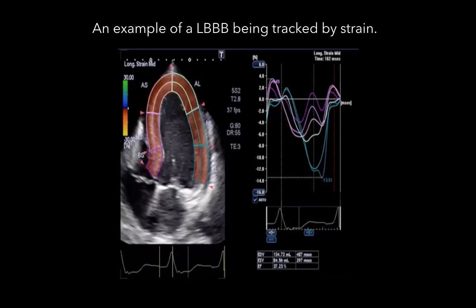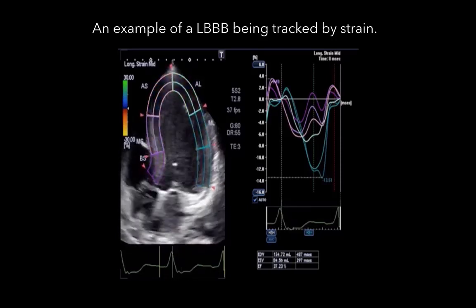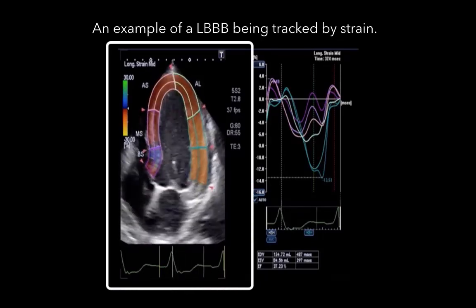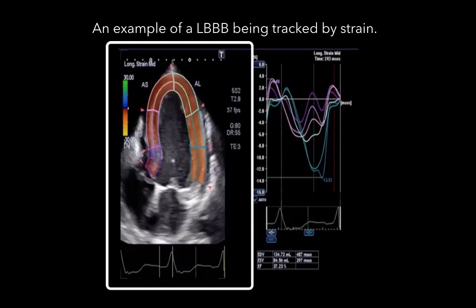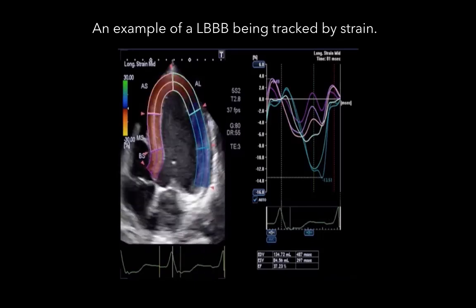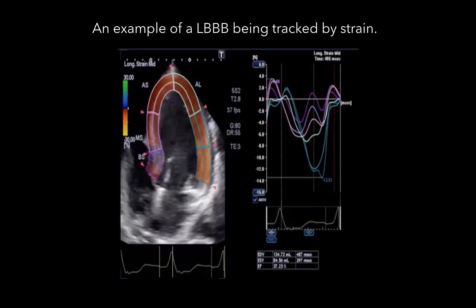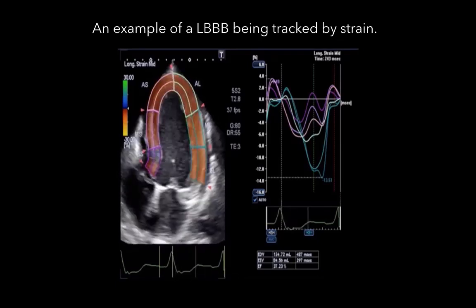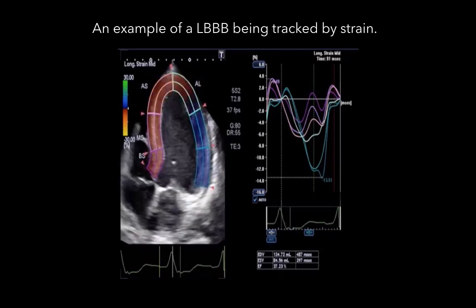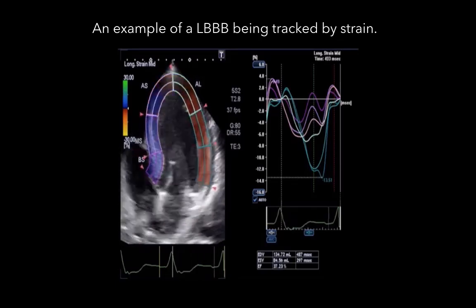This is an example of a left bundle branch block tracked by strain to highlight the pattern of contraction. Note how the red, representing contraction, progresses from the septum on the left to the anterolateral wall on the right. This represents LBBB effects on ventricular contraction rather than true akinesis of the septum. The key message is to always refer back to the patient's rhythm and QRS when interpreting echo, using the monitor or ECG leads on the echo machine.